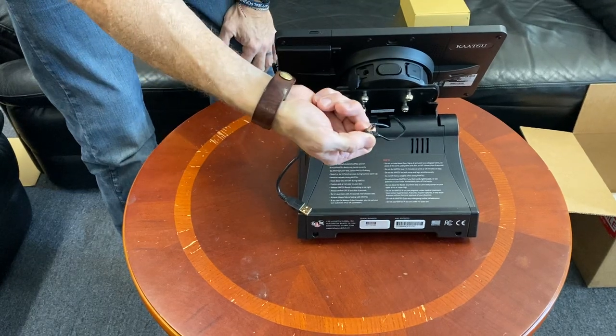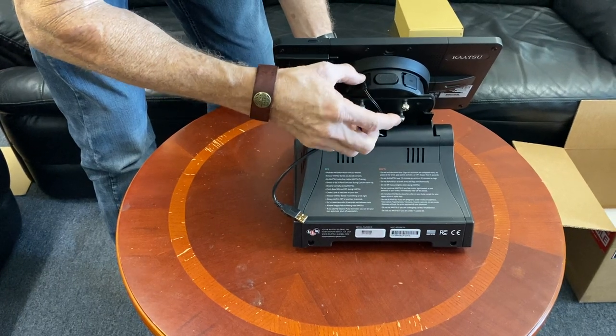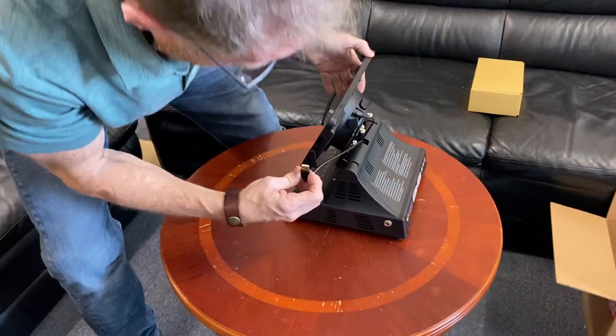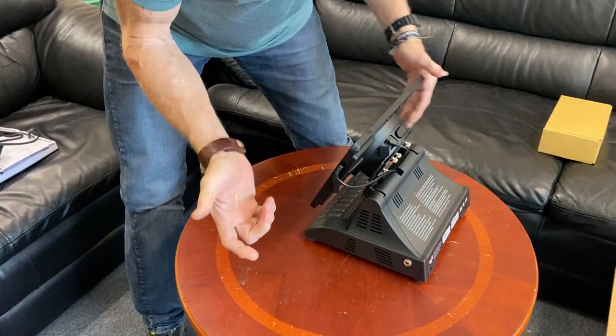It's very easy. There's only one place this power cord goes and it's right up here. Just press it in and click it right in, and then the USB-A connects right here on the side — you'll hear it click like that.